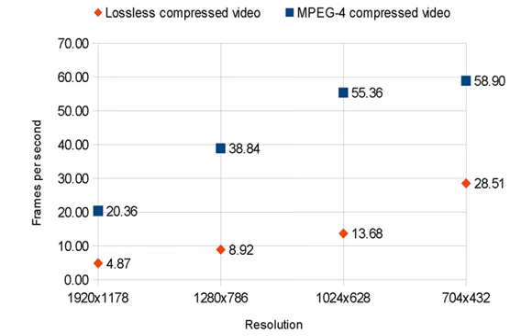Our video enhancement techniques compensate for vision loss due to AMD. We make four novel contributions. First, our methods are based on face tracking technology that provides a good indication of regions of interest in video footage. Second, our blended filtering method enables filtering face and non-face regions differently and to blend both results seamlessly. Third, our constrained scaling method allows scaling multiple faces consistently based on the actual video content and on perception constraints. Fourth, both methods and their combination are real-time capable.